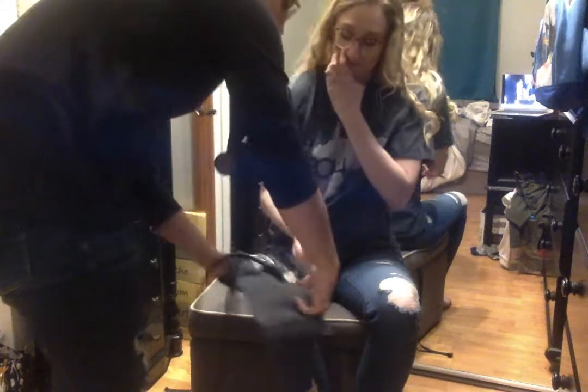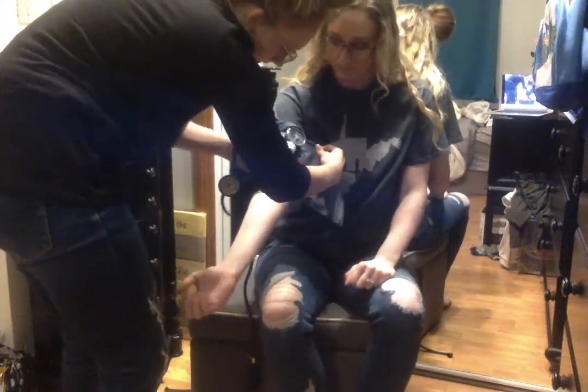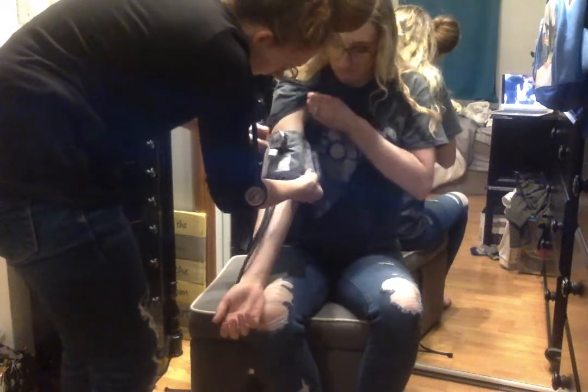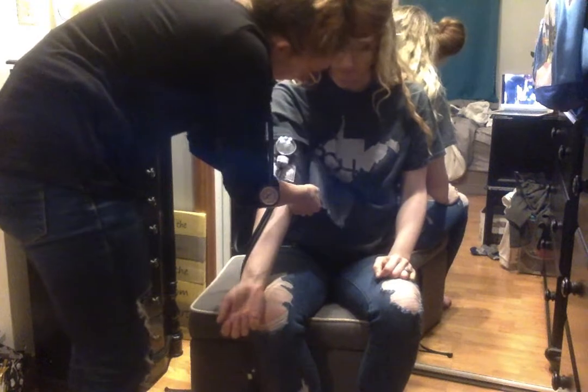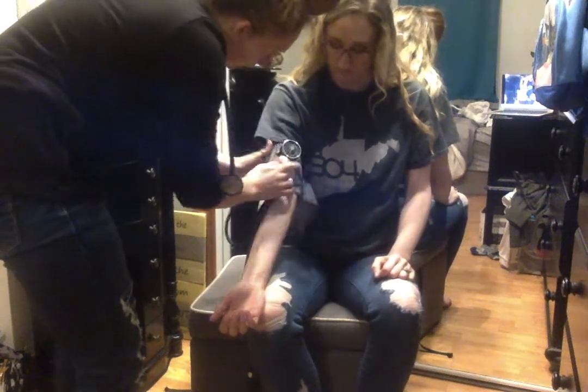regimen. I'm going to start by taking her blood pressure, and then I'm going to calculate her ABI and do the Allen test. So to start with the blood pressure, I'm going to put it on her right arm and align it above her artery. And tighten it. Snug, but not too tight.